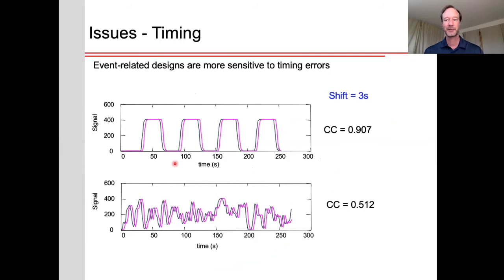Also, some issues related to timing. Note that event-related designs are a lot more sensitive to timing errors. First of all, we ideally wouldn't have any timing errors, but this is particularly important to keep in mind when we're dealing with event-related designs. For example, here, if I have a block design run, and if I shift the ideal response by 3 seconds, we still have a very high correlation coefficient of 0.9. However, an event-related design would be reduced from a perfect correlation down to 0.5. So just a word of caution to really be careful about the timings and inputting these correctly.